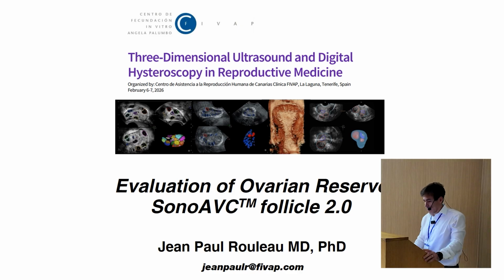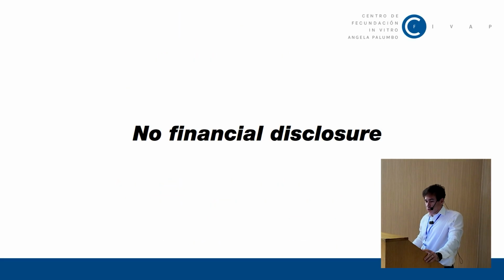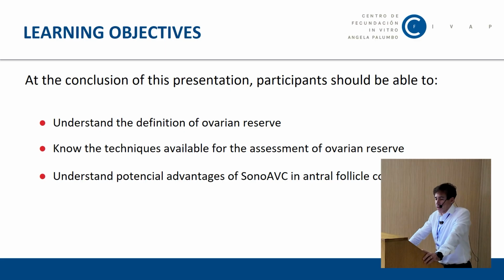this technique. I have no disclosures, and at the conclusion of this presentation, participants should be able to understand the definition of ovarian reserve, know the techniques available to assess the ovarian reserve, and understand the potential advantages of SonoAVC in antral follicle count.